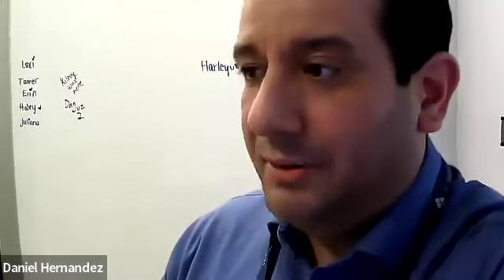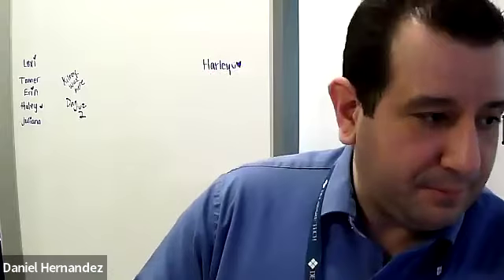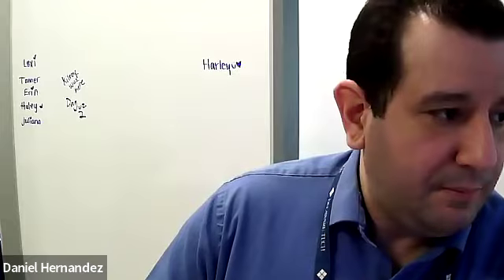With appendix, it's a lot of pressure. So this exam requires a heavy hand. So you really need to be able to push and exert a lot of pressure on the child. Unfortunately, if they do have appendicitis, it's not going to be comfortable. So gradual graded compression is slowly applied over the area of the appendix in the right flank, right lower quadrant, again using your high frequency linear transducer.